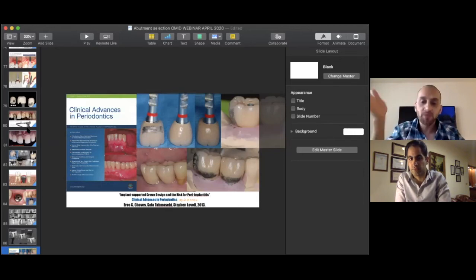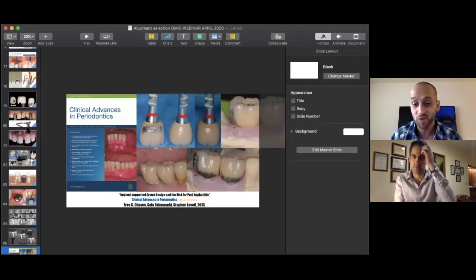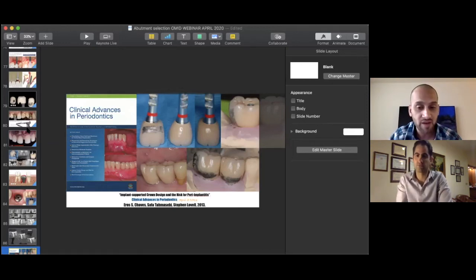So I think it should be concave to allow for peri-implant soft tissue. I think in certain instances where you need to push that soft tissue a little bit, yes, maybe. And I think Dr. Chu has published a couple of papers about that. And I know you yourself talk about this a lot. And I think it's case by case also. And also the depth of the implant is very important too.